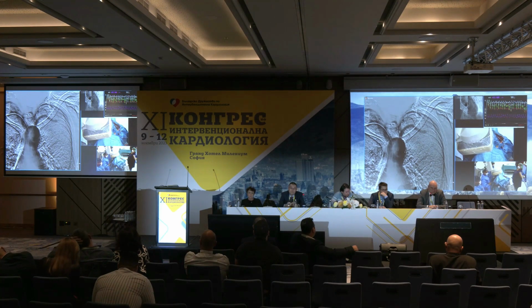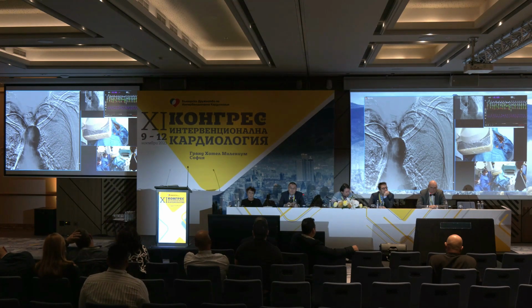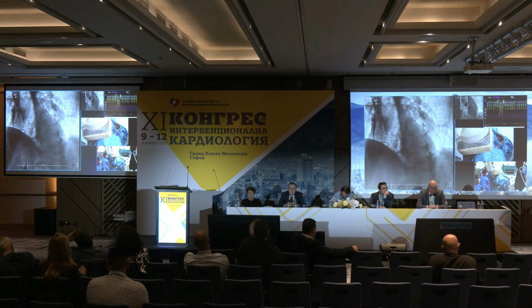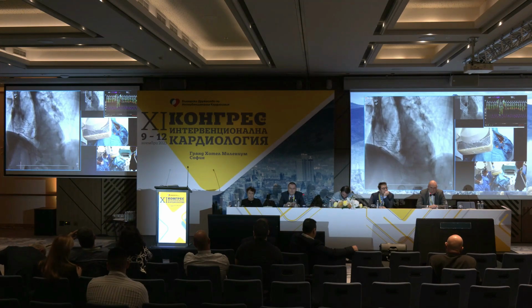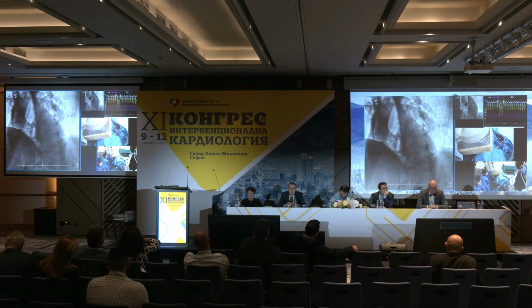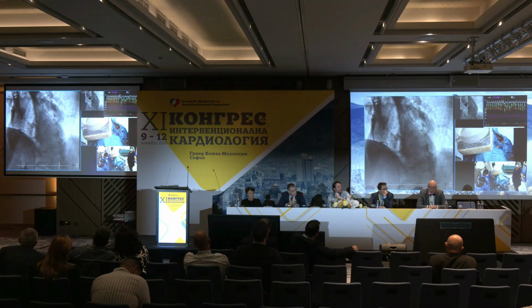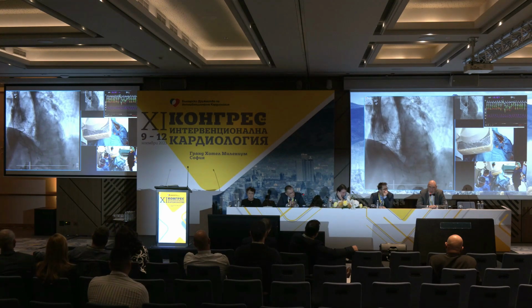I mentioned the valve is in a very high position, absolutely by purpose, exactly with this aim to reduce the probability for pacemaker implantation. You see in this projection, it's practically on position 0. And yeah, we'll see. We'll check tomorrow and we'll decide. Because in this situation, it's a high risk of late block, which can be on the 3rd or 4th day.